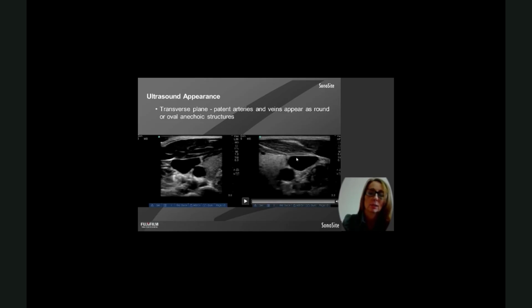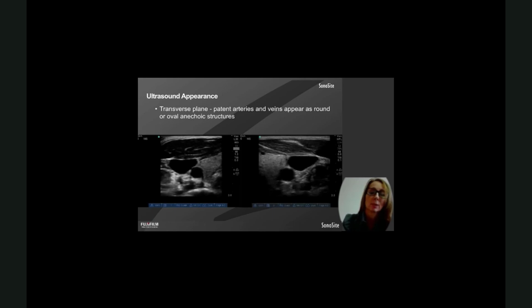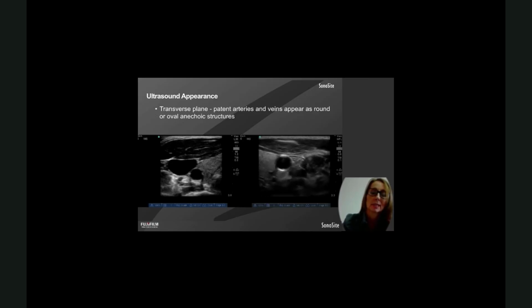Your arteries are usually round and firm, and your veins, particularly the bigger veins, can be a bit wider, but in your arm vessels, these are neck veins, but in your arm vessels, this would probably appear rounder and slightly bigger. But the trick is to compress the vessels, and you'll again see straight away that the artery becomes pulsatile and stays round, and the vein compresses quite flat.